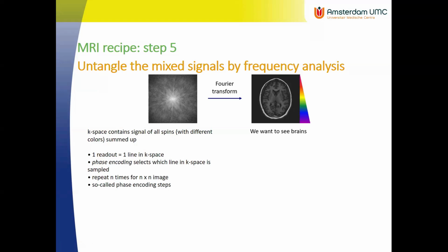Also, it is the reason why MR scanners make so much noise, if you ever heard one scanning, they make a huge noise, like 100 decibels maybe, depending on the scan you're doing. It happens because you do the fast gradient switching all the time. So you switch on the slice selection, that makes noise. The frequency encoding switches on and off, that makes all the noise. So these are actually the same gradients I'm talking about as Petra mentioned yesterday during the diffusion imaging.